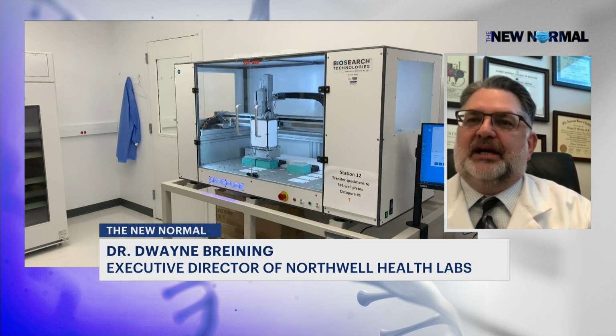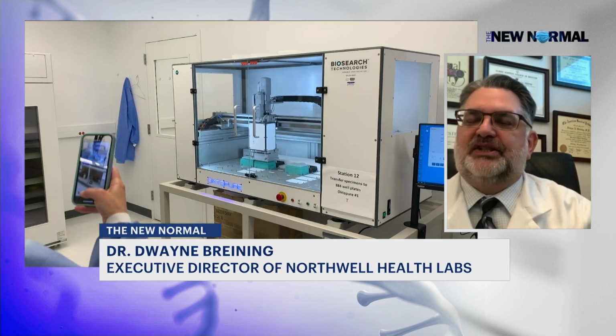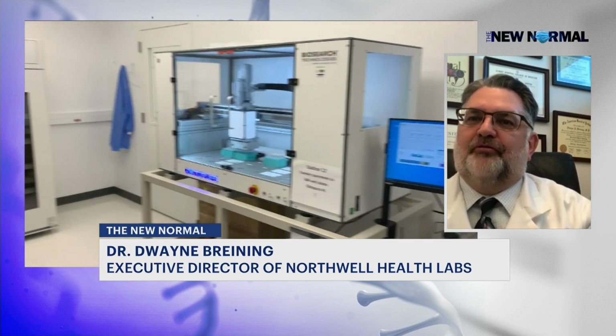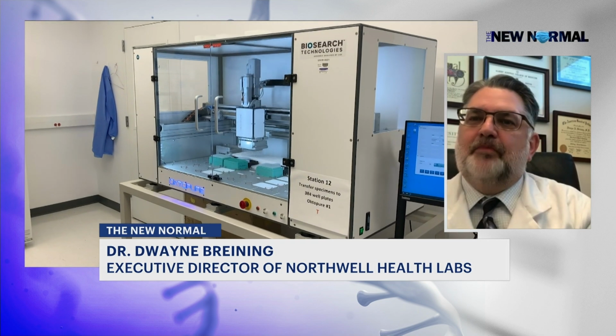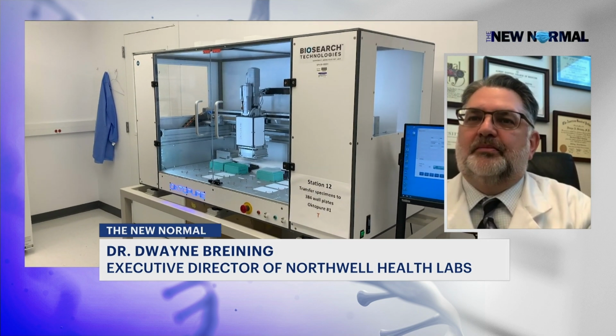The minute we got a positive, we would just start testing all of the positives to see if it were one variant versus another based on whether or not it had that mutation. We haven't had to do that yet, but we're preparing for it if it becomes something we have to do.